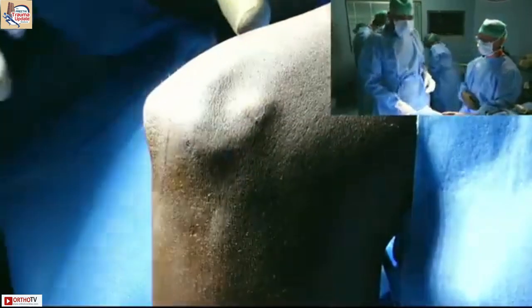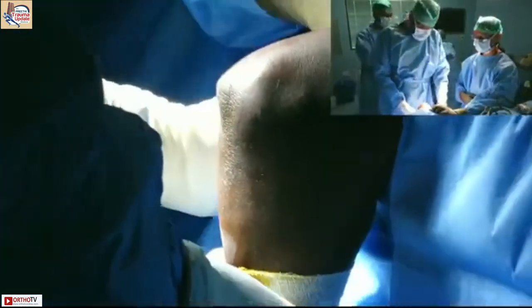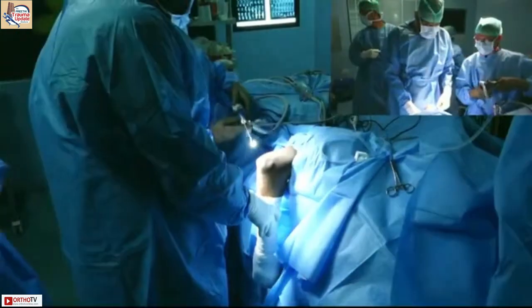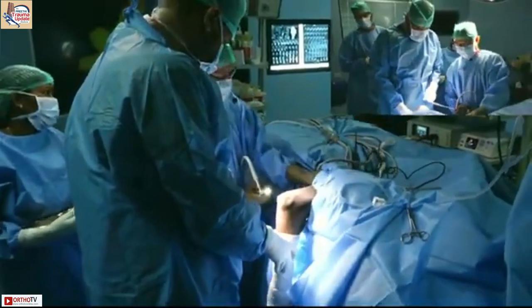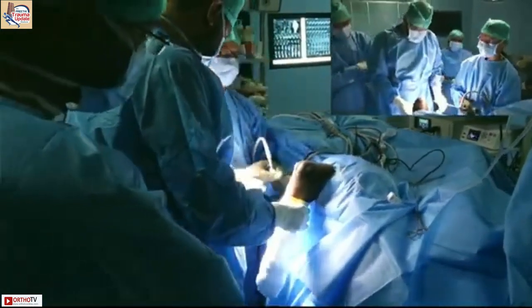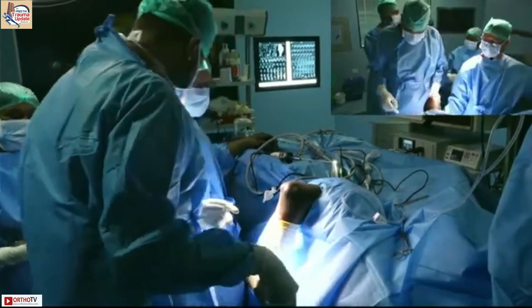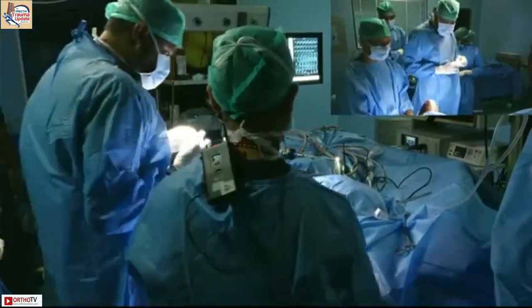Can I request the cameraman to just focus on the position of the surgeons, the tower, and how the whole setup is placed? Okay. So Dr. Abhijit is standing on the... Let me see if I can push the patient while you're doing it. You want me to hold it? So the tower is on the back. Let me hold it. Back. And this side, the surgeons are standing in front of the body or the face.